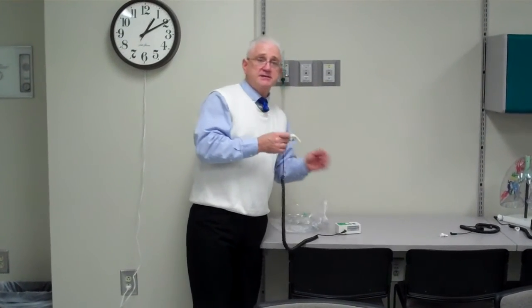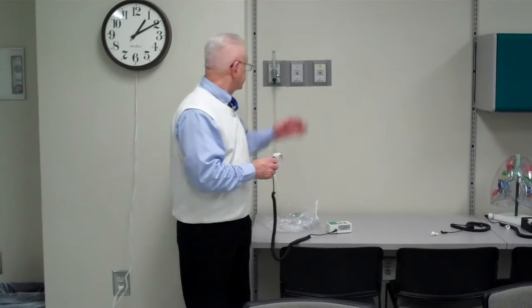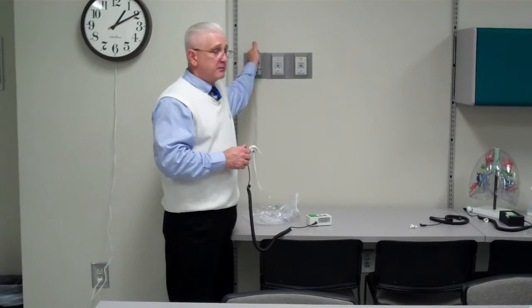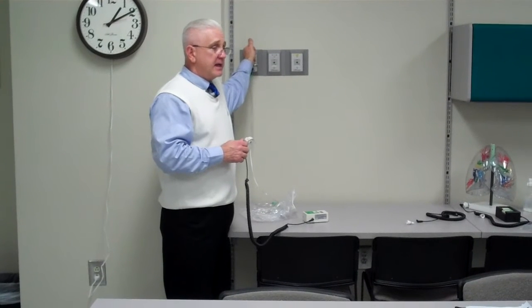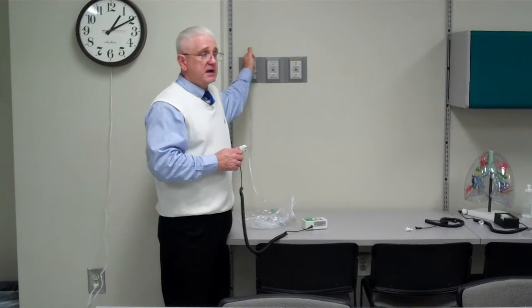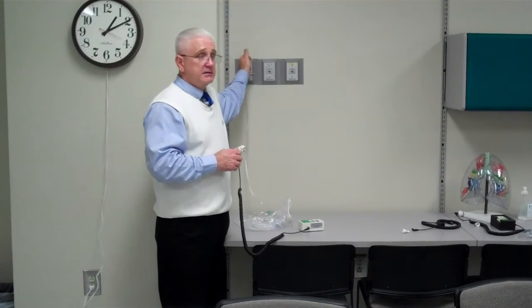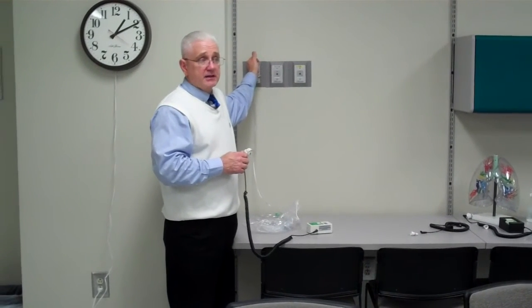What we do know is that we have two known constants. One is that we have 99.5% to 100% pure oxygen coming from the wall, and we know that room air constitutes about 21% oxygen, 78% nitrogen, and the others are trace gases.